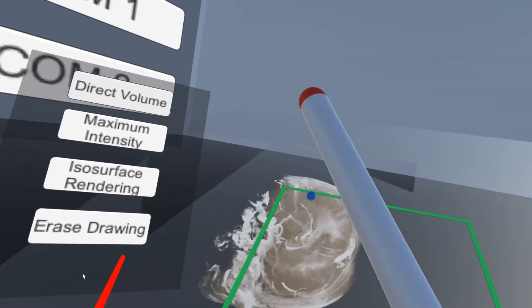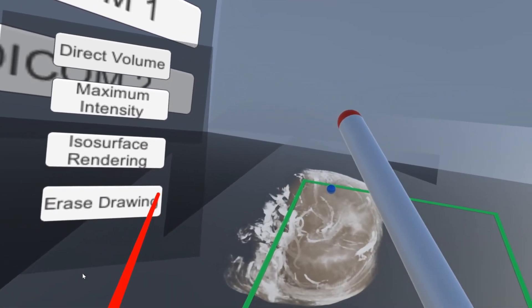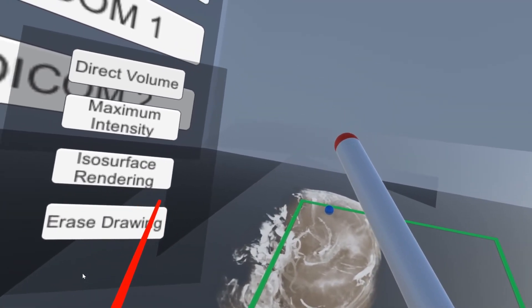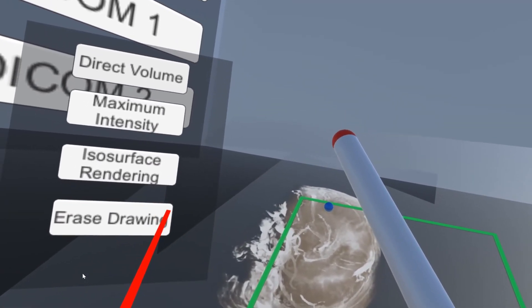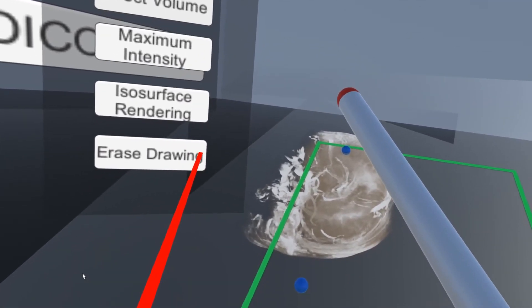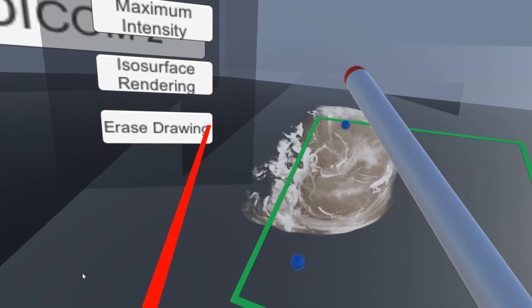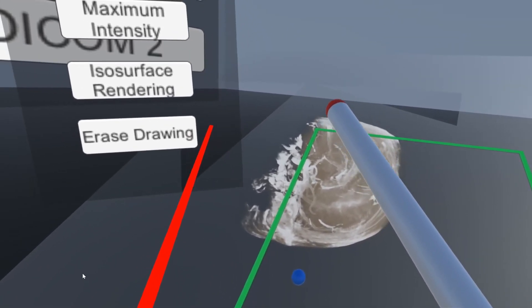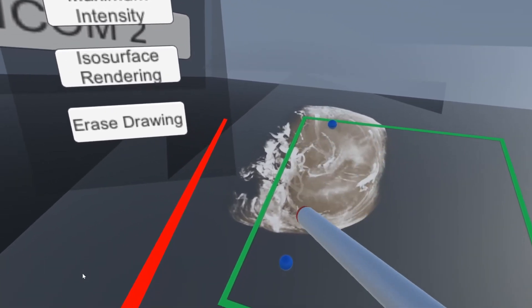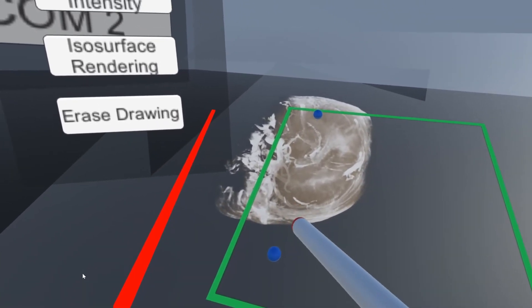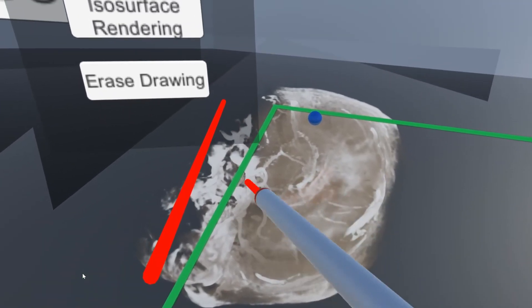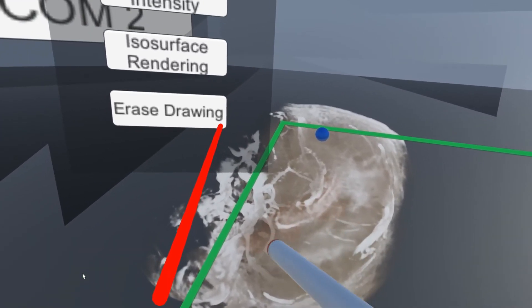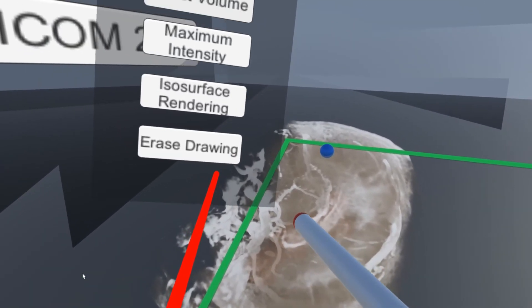And finally, they can also use this pen on the right controller to mark stuff on the whiteboard side here, which is this planar view.